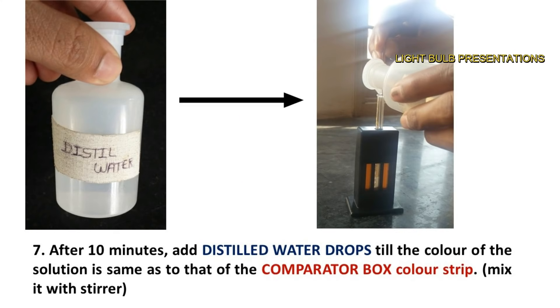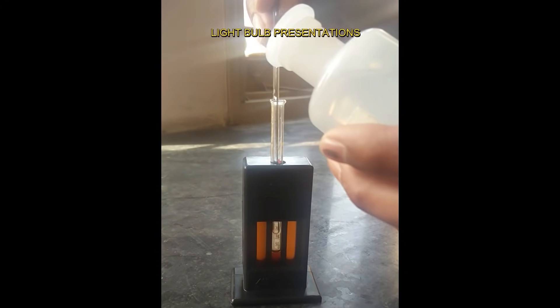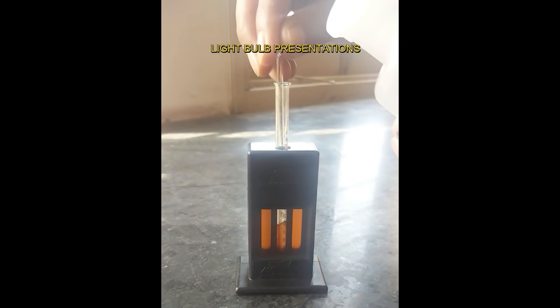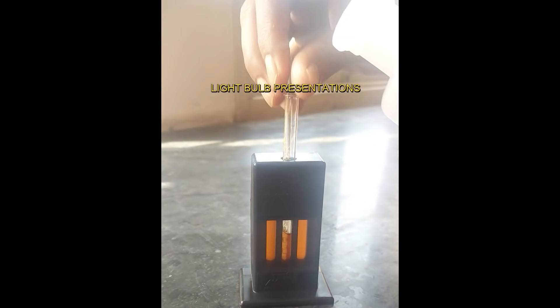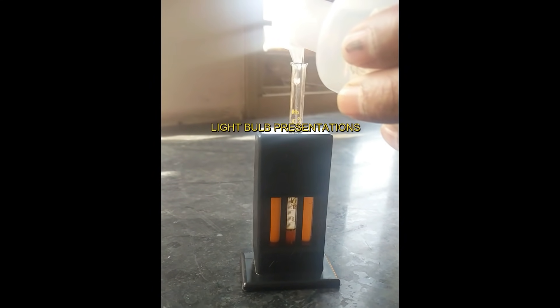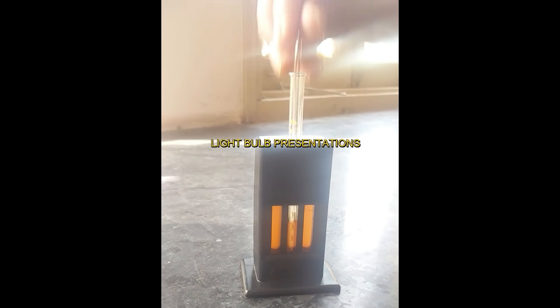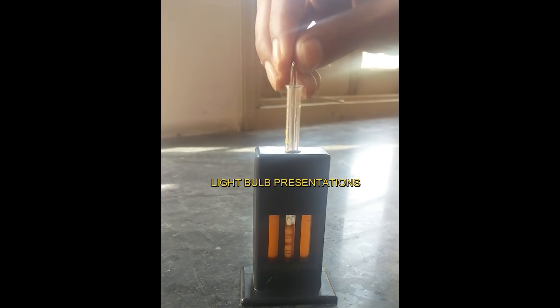After 10 minutes, add distilled water drop by drop until the color of the solution is the same as that of the comparator box color strip. When adding distilled water, mix the solution with the help of the stirrer. The color of the acid hematin solution should be checked frequently to prevent over-dilution.